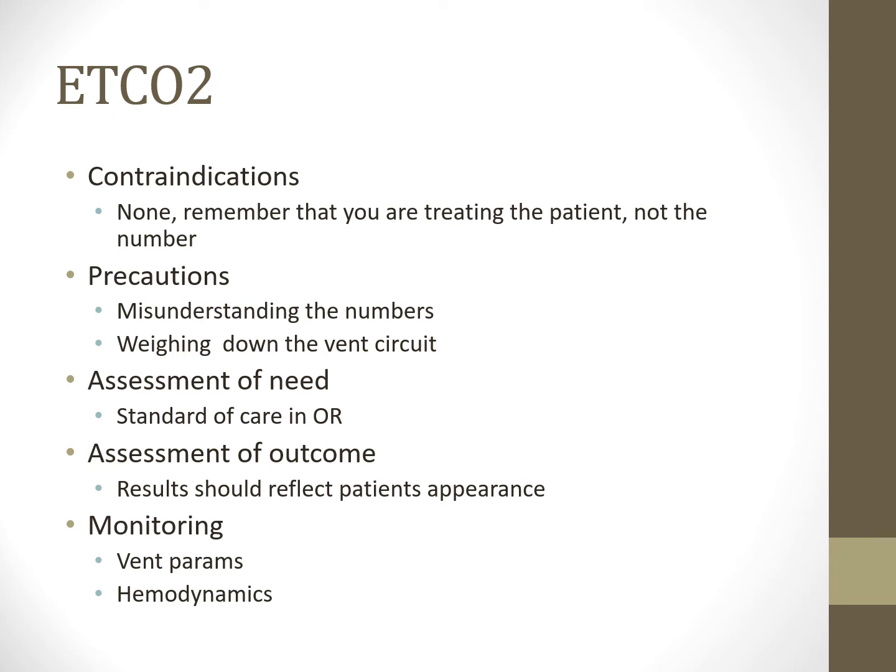These are standard of care in the operating room. Thank goodness. That's one of the big things on all those vents. They usually all have end-tidal CO2 monitoring. Most of our patients at Swedish, if they're on a ventilator, they have end-tidal, right? That was one of our standard things. It is a very important thing to have.